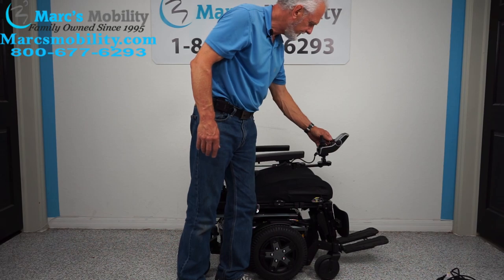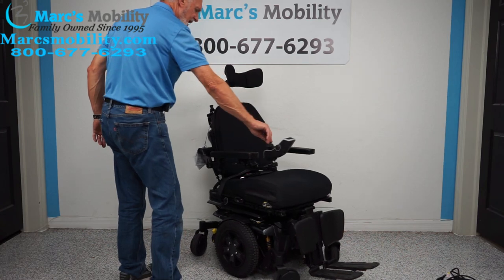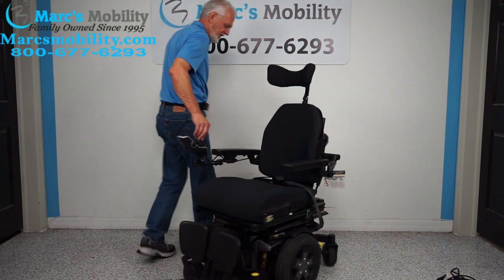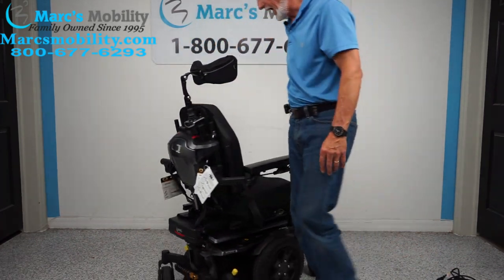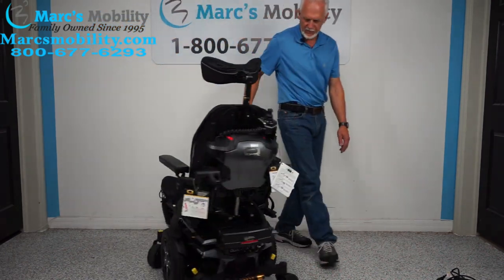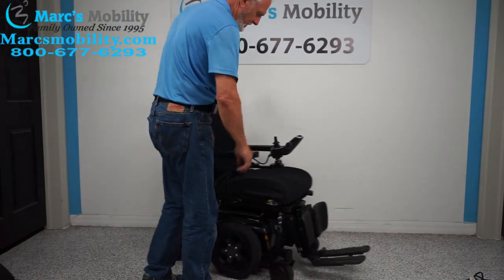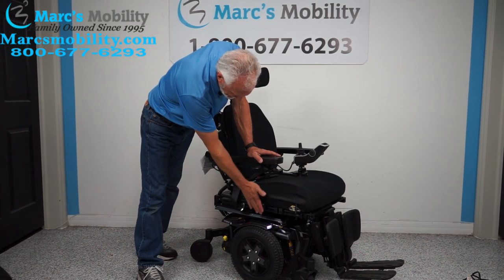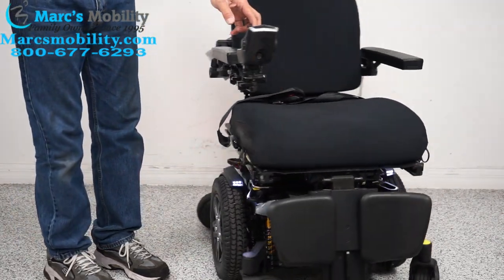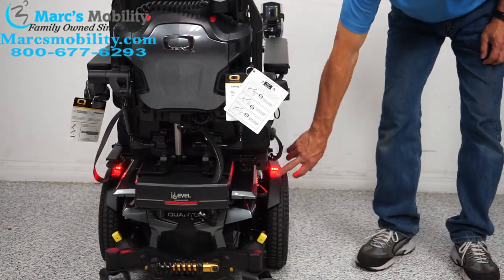As I mentioned, it's a mid-wheel drive so it turns on its own length. If you're in the house, look at how it turns in a circle — I can stay in the same spot if I want. Another feature: there's a little button here, and if I tap it, I get rear lights and headlights on both fenders. This chair has factory-equipped front and back lights — headlights and taillights.